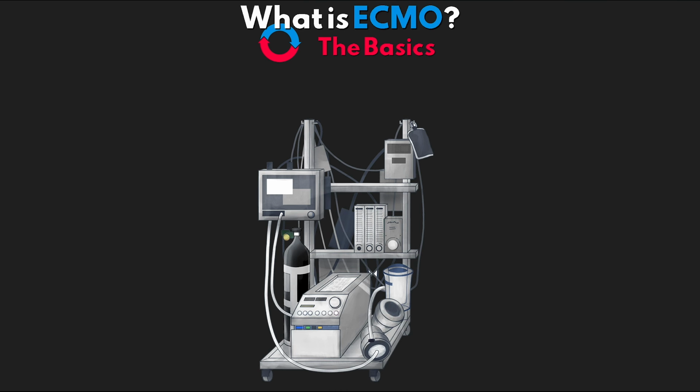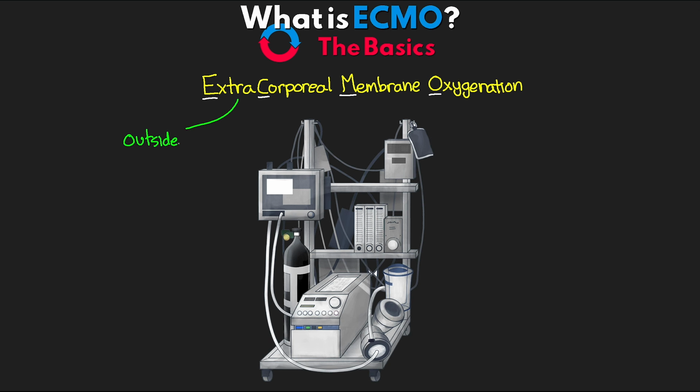ECMO is an acronym that stands for a type of life support that we call extracorporeal membrane oxygenation. And this part here, extracorporeal, this means outside the body. Now, other examples of extracorporeal therapies would be things like hemodialysis, as well as some ventricular assist devices. But in its most basic definition, ECMO is oxygenating blood via a membrane oxygenator that's outside the patient's body. In reality, though, it is much more than just that.